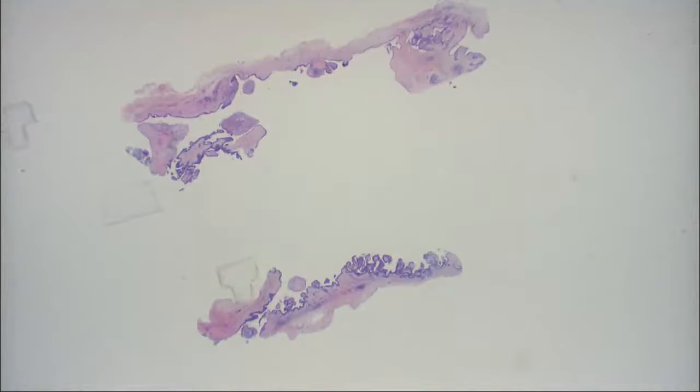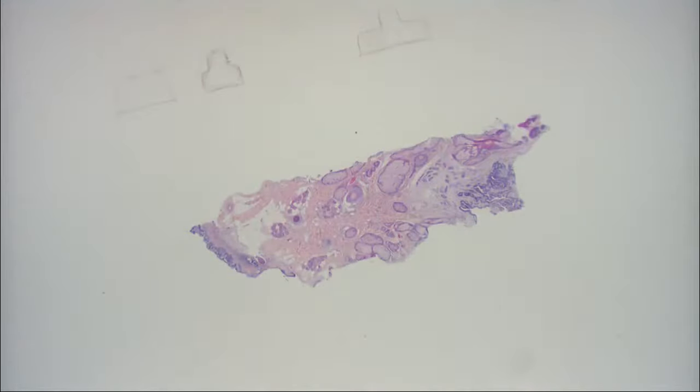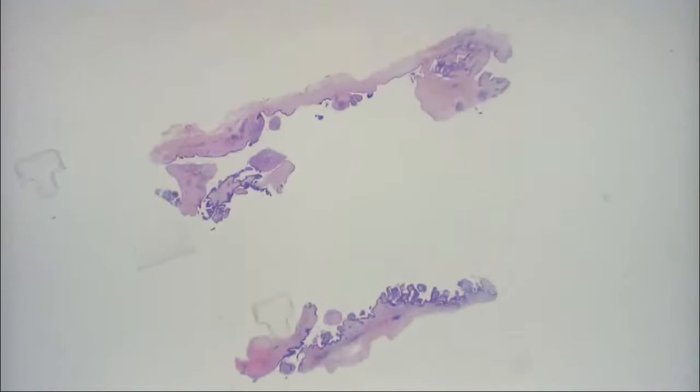So this one I wasn't really sure. It looks like it might have just been taken off in parts. Or when there's no epidermis at all, they either did a really lousy dermatologic surgery biopsy, or the lesion might actually not have much of an epidermal component.